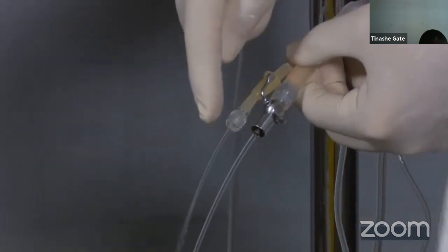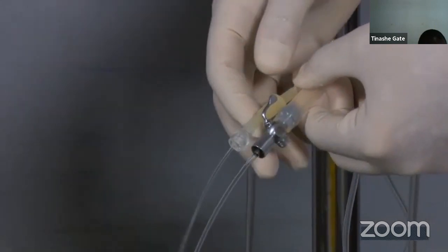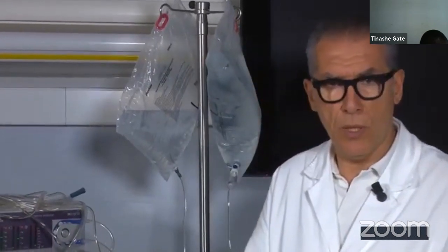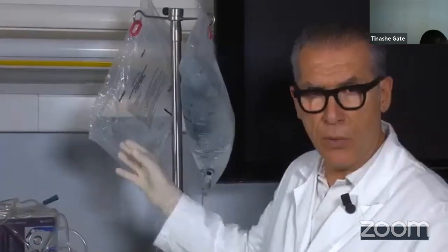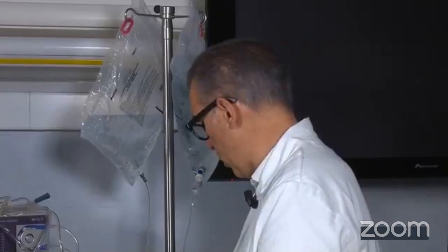This is still higher than this one, but you see much less than before. Okay. So this is the concept of when you want to use the gravity pressure. There are two main variables: the diameter of your output silicone tubes and the amount of liquid in the sac. As soon as the liquid decreases, you will get less pressure in the tube. That means less flow. Okay? So this is concept number one.